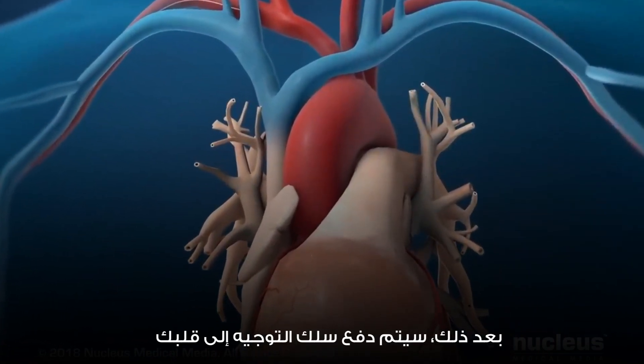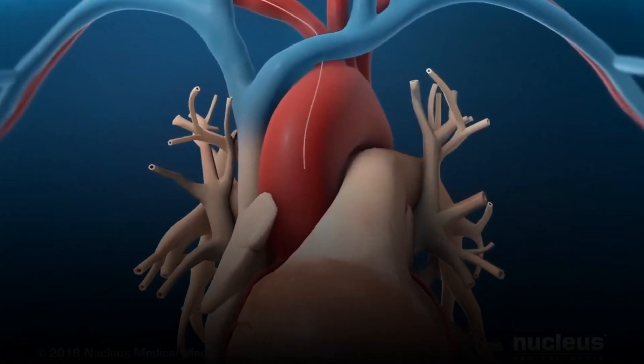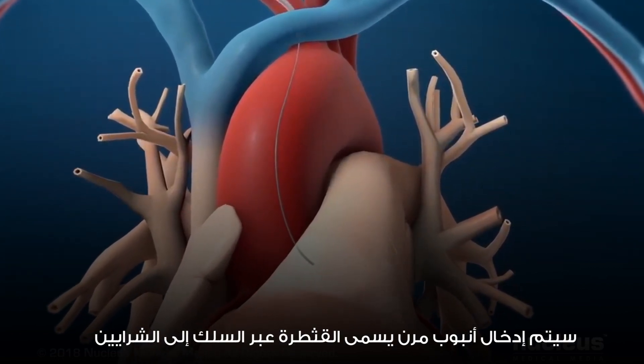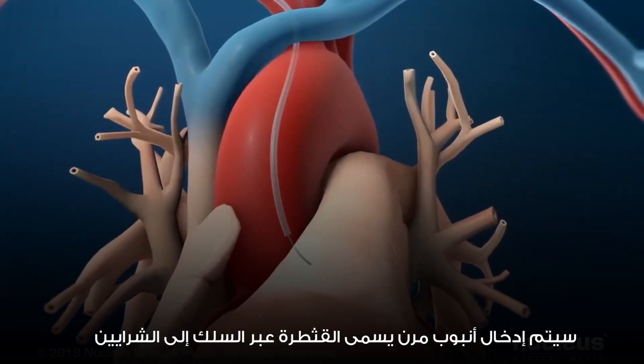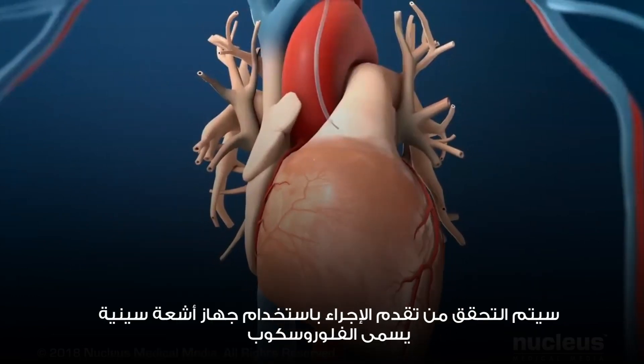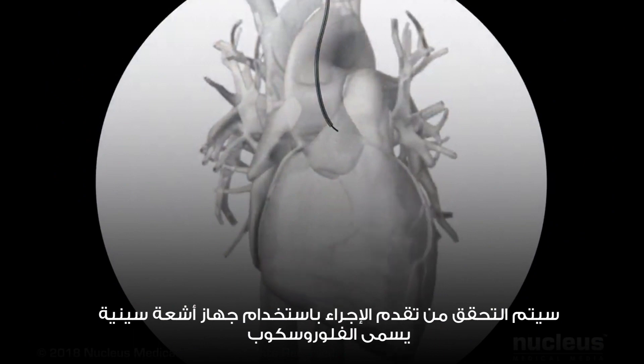Next, the guide wire will be advanced up to your heart. A flexible tube called a catheter will be advanced over the wire to your coronary arteries. The progress of the procedure will be checked with an x-ray device called a fluoroscope.